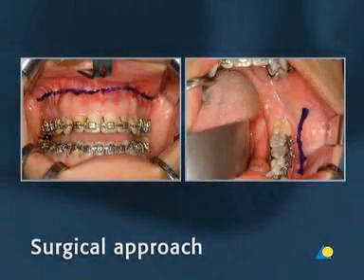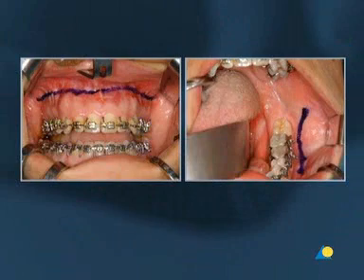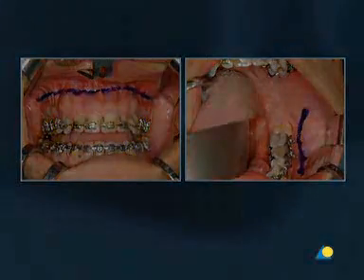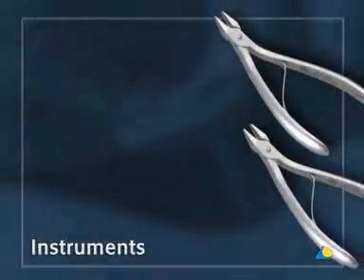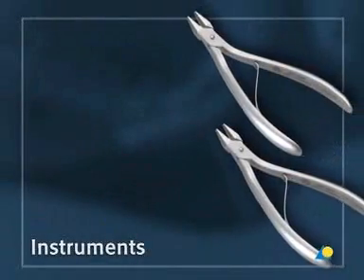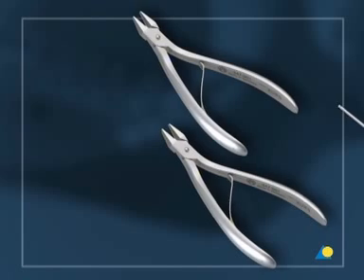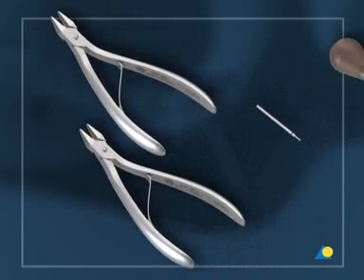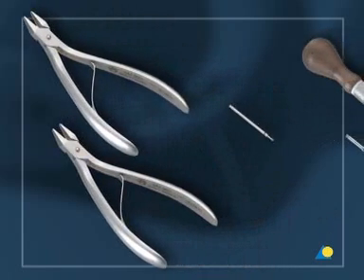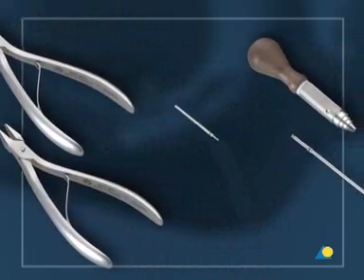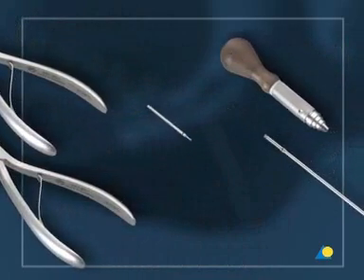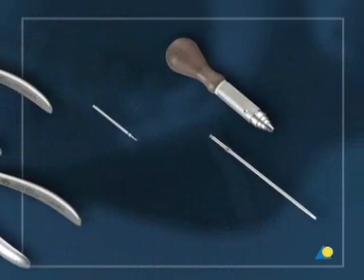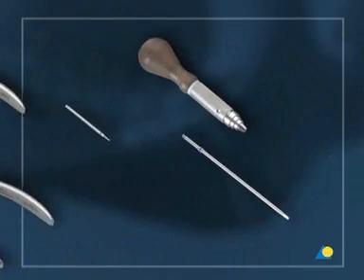In a clinical situation, access to this fracture would be through an intraoral approach. In this exercise, the instruments needed are two bending pliers, the 1.5 mm drill bit with 6 mm stop, and a star-drive screwdriver shaft with handle.